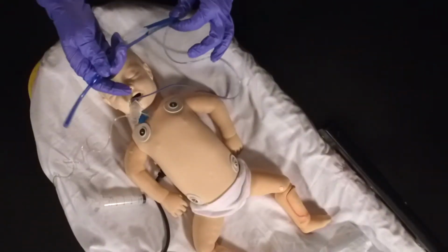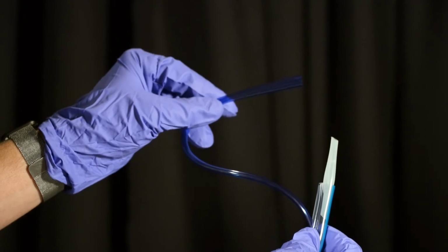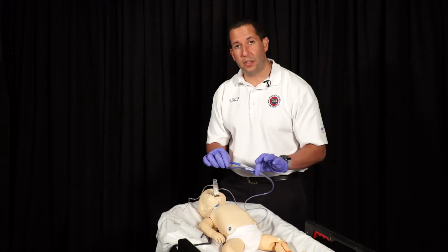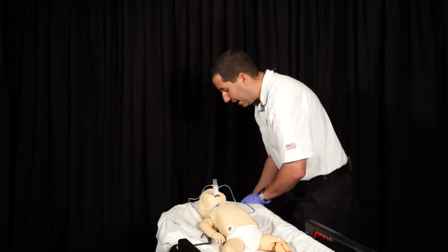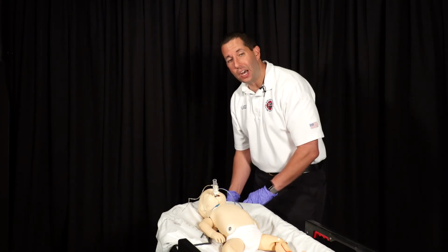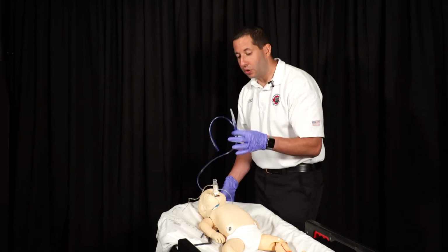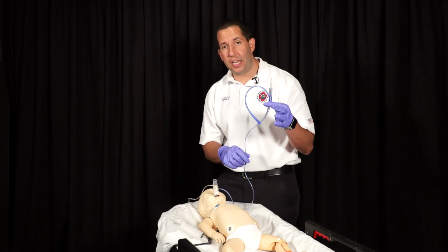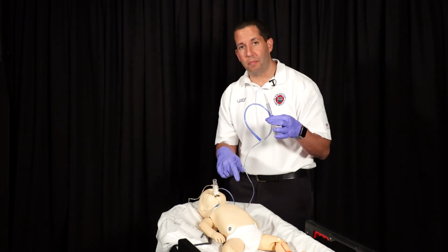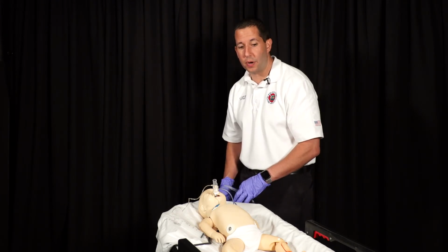The next part of this is the running end of the gastric tube. The blue is always going to be left open. You're never going to seal the blue off. That's not what this is meant for. If you hang it down lower than the stretcher itself, you might drain some gastric content out of the baby's belly. So if it begins to drain and it starts going all over the back of the truck, real simple, pick it up, let gravity take its course. The belly will still be venting and the gastric content will be going back down into the stomach. Or you could just stick it into the trash can in the back of the rescue truck.